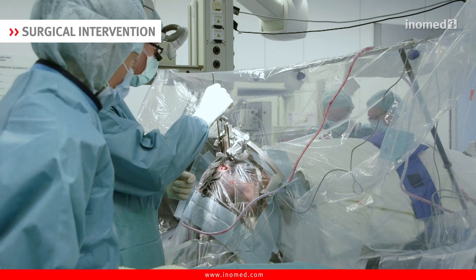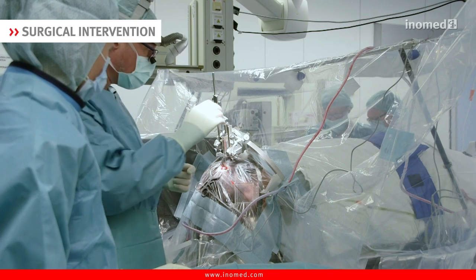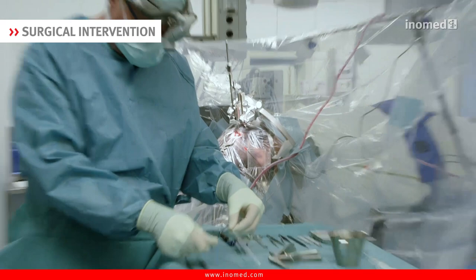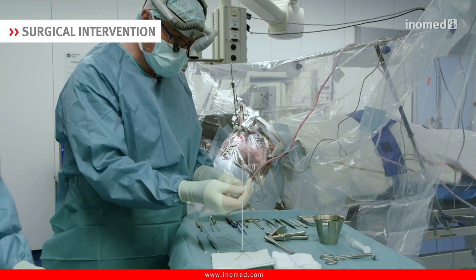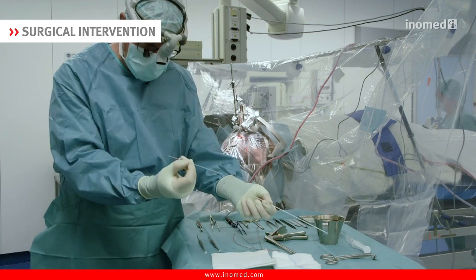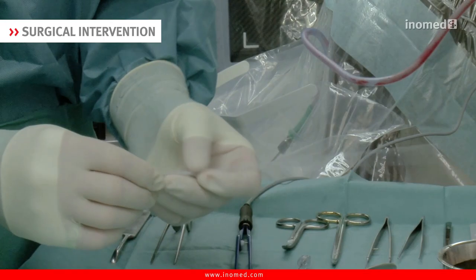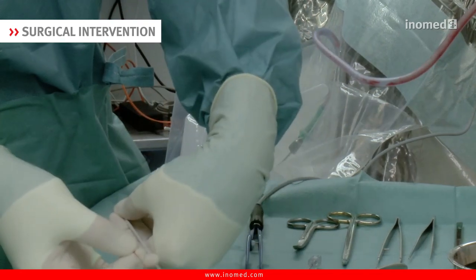Now I slowly go down with the Backlund biopsy probe. I have to be careful that there are no deviations when inserting the probe, because deviations at the edge of the bone would lead to a large deviation in depth. This catheter, which we use to insert the seeds, consists of three parts: the outer catheter that comes into the situs with a mandarin, and the slightly thinner inner catheter, which is inserted into the outer catheter and into which I will fill the seeds. The red catheter in turn serves as the sole for the inner catheter, fixing the seeds in the depth.